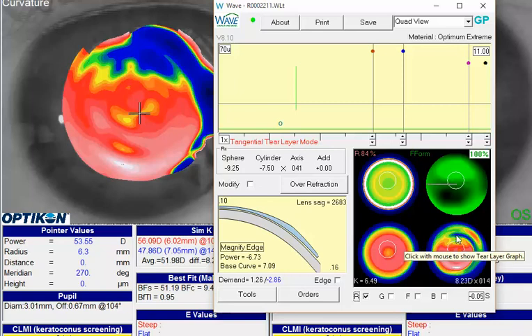Now again, you're going to have to almost use an empirical approach. What I like to do quite often, if I have the ability, is to put a known diagnostic contact lens from my regular fitting set on the eye, known parameters, so that I can over-refract and get some true clinical data, and that helps guide me in some of the decision making.